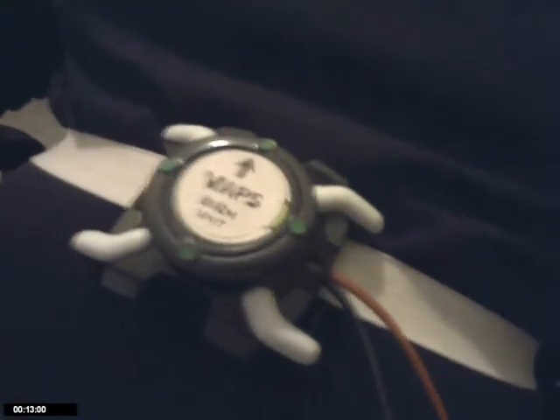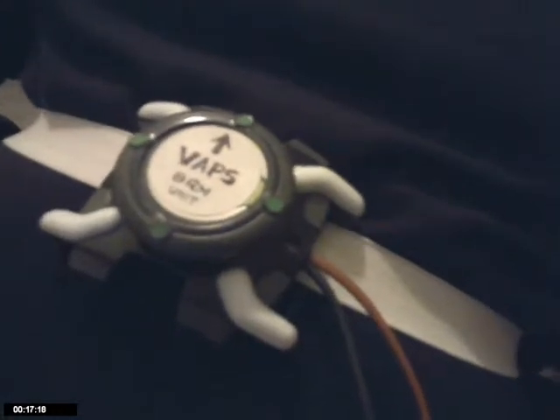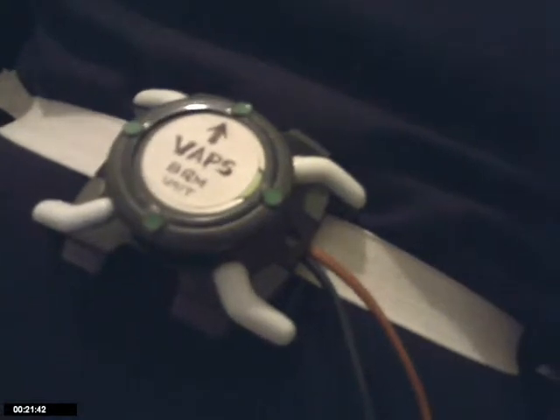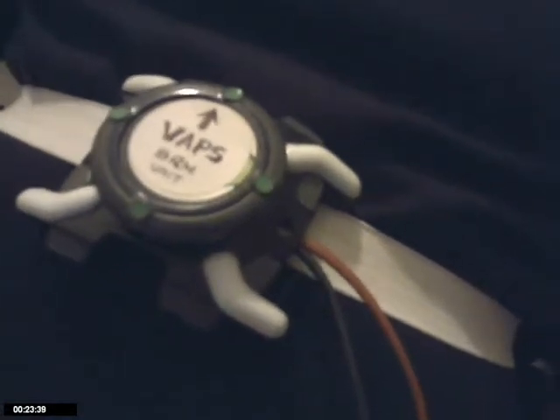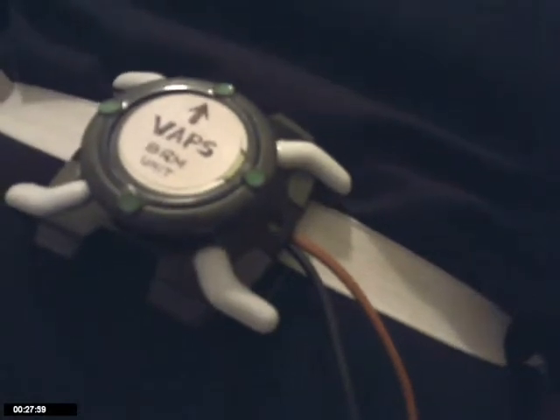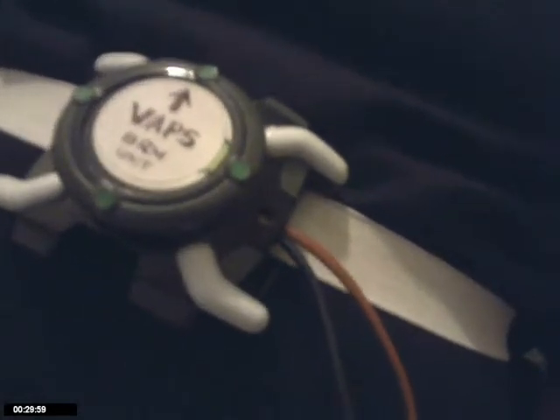Hello friends, I give you my phase 3 update of my project, the Vaps. I've been busy trying to make the breath rate monitoring unit, which is a pretty complicated component in this project.